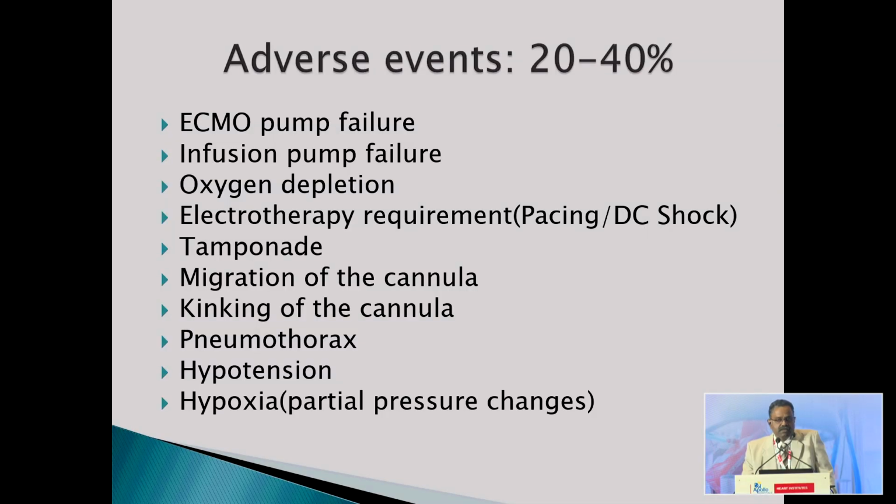Adverse event chances are around 20 to 40% depending on the center, and this can be due to multiple factors. It can be due to an ECMO pump failure, either the pump itself failing, or else due to an electricity failure. In that case, we need to change the pump, or if there is an electricity failure, you have to hand crank. For infusion pump failure, always have some infusion pumps on standby, and the team should be geared up to calculate the dose and run it in the saline bag itself, instead of depending on the infusion pump. Or oxygen depletion can happen.